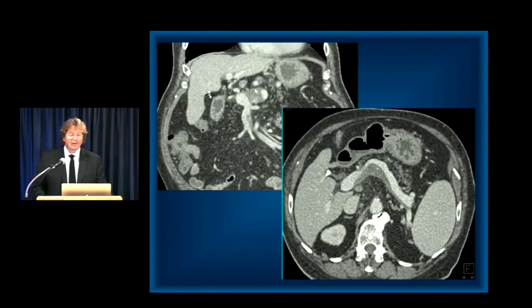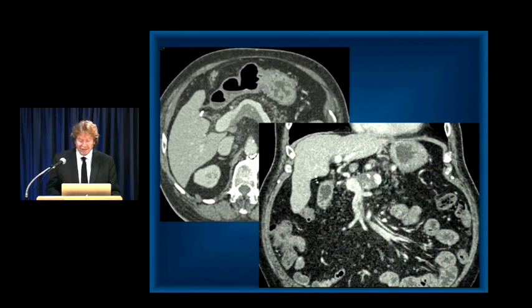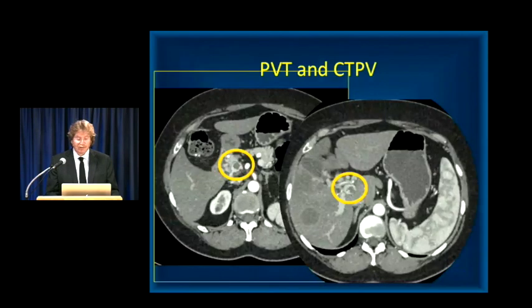Again, you want to be very careful. Portal vein thrombosis can extend into the splenic vein and SMV. You want to look at that carefully. And the enhancement patterns can be very variable. The changes in this case really are indeed very minimal, and it's really not all that impressive. In other cases, it's substantially more impressive.